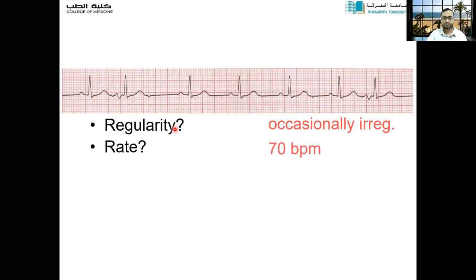Heart rate, normal. P waves: the 2nd and the 7th P wave are different in shape or contour. You see the first P wave, look at the 2nd P wave, how it looks, different in shape. It's biphasic, with a positive component and a negative component both in it. This is normal, this is normal, this is normal, this is normal. Again, the 7th one, same. It's different in shape. What else?